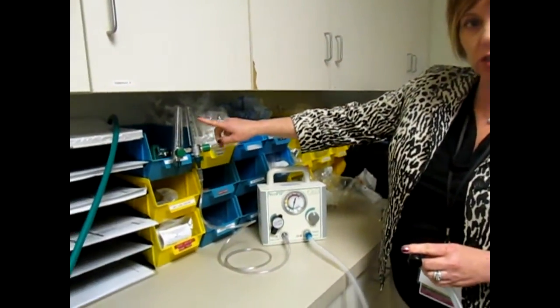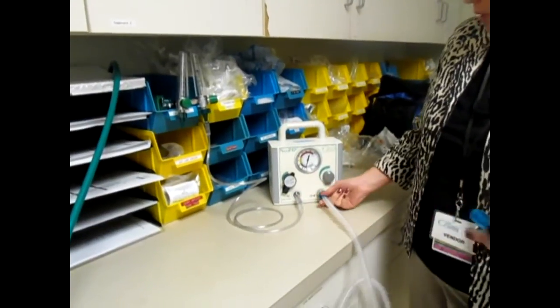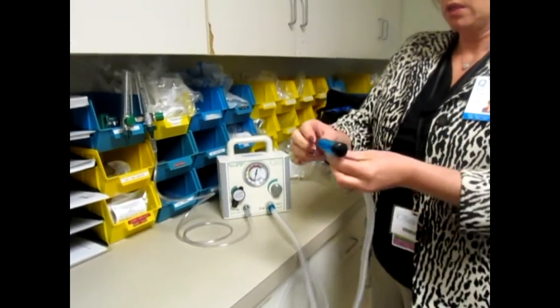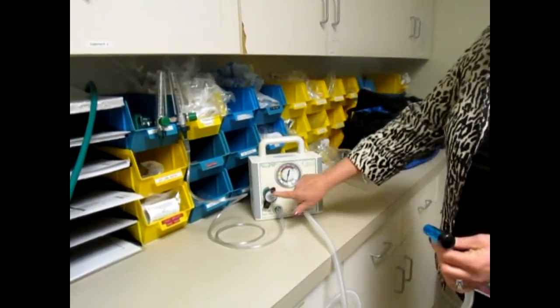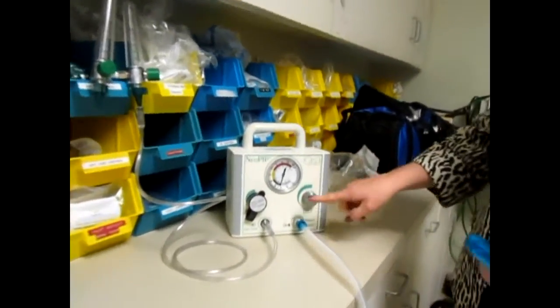So six liters of oxygen to turn the machine on, plug it into the gas inlet. Your patient circuit goes here. There are three knobs that you need to worry about, two on the machine. One is your pop off, one is your peak inspiratory pressure.